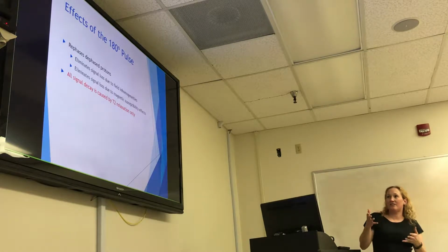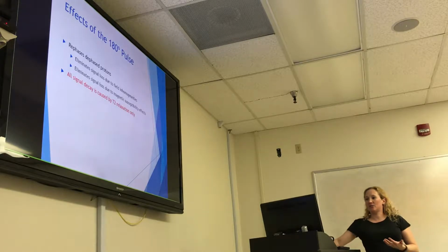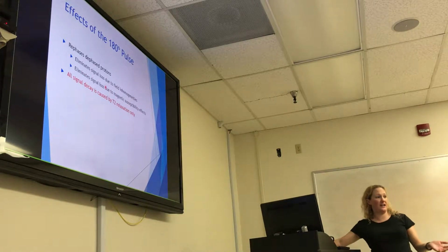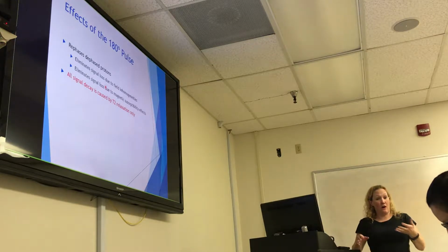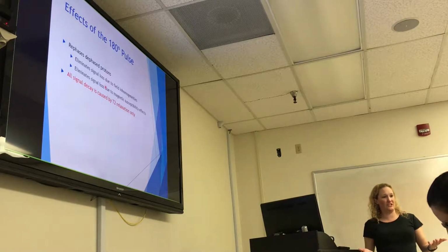The effect of our 180 rephasing pulse is that it's going to rephase our dephased protons, and bring them back together. So it eliminates these two types of signal loss. Our field inhomogeneities: remember we talked about the fact that the magnetic field on that microscopic level is not going to be exactly the same in every spot. And we know from our Larmor equation that when our field strength changes, our resonance frequency changes.